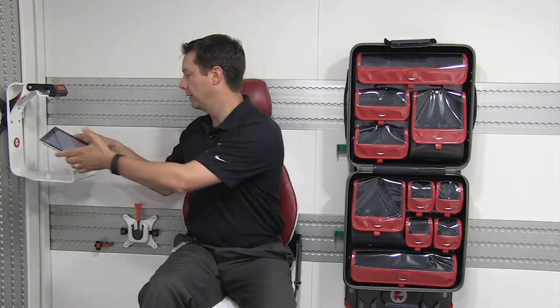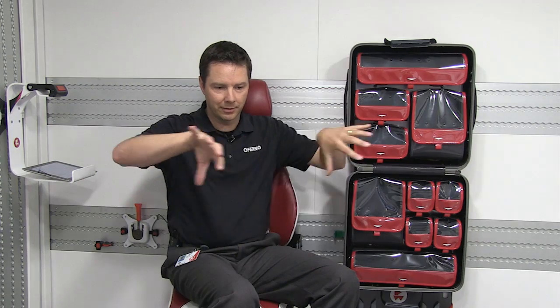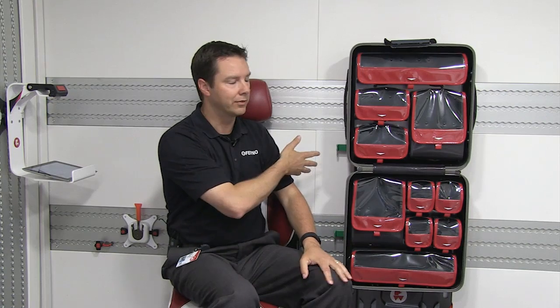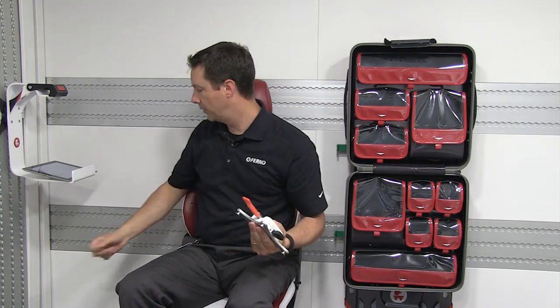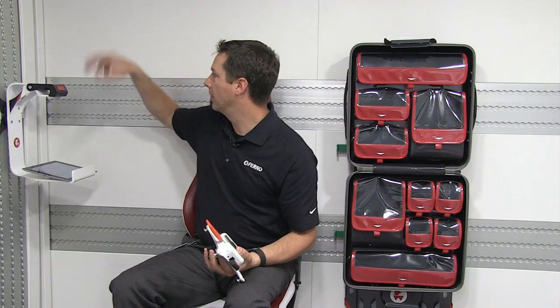Great question, super question. With the track and mount system, what you're able to do is, instead of having to deep clean everything right there inside the vehicle, which can be tight and organisms can tend to live in places where you don't access very often, this ambulance design is essentially like a big open interior with a very smooth wall system, and all these individual mounts very quickly can be removed. So you can remove everything out of the ambulance in a matter of minutes and hose it down, wipe it down, whatever you like to do.